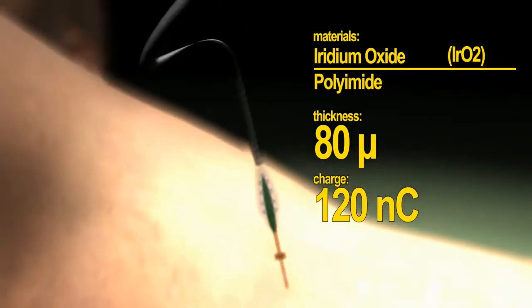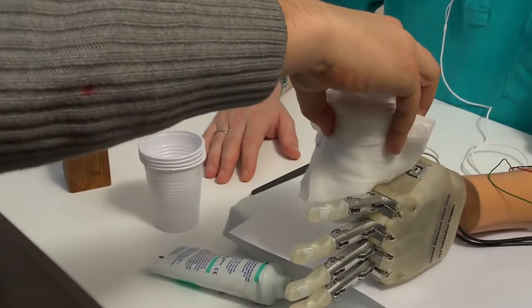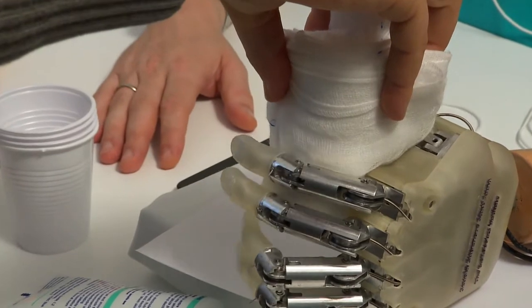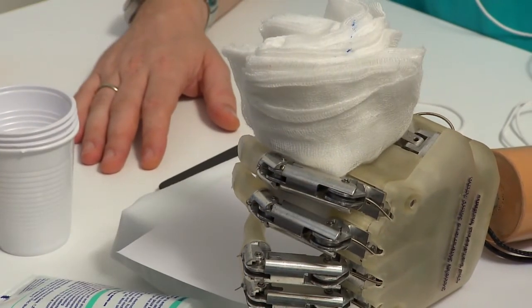This approach could improve the efficacy and lifelike quality of hand prosthesis, resulting in a keystone strategy for the near natural replacement of missing hands.